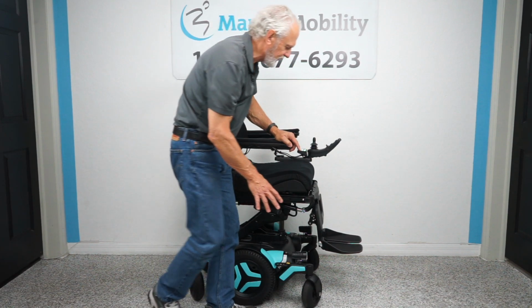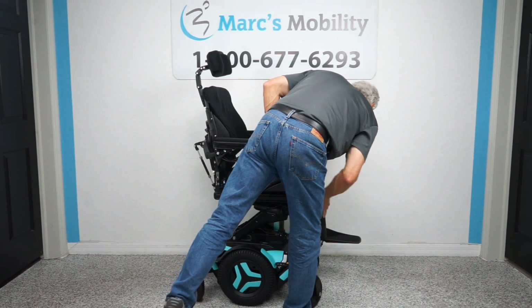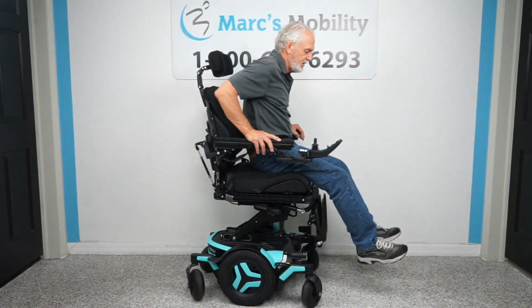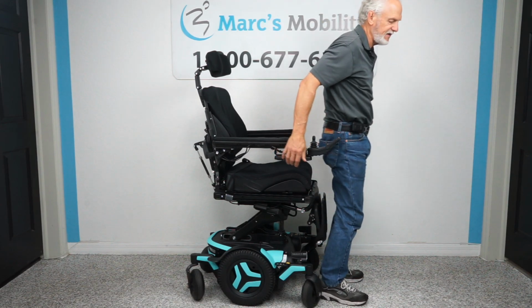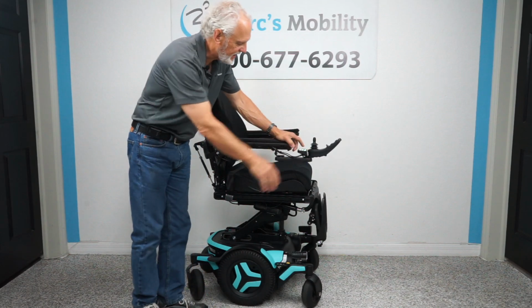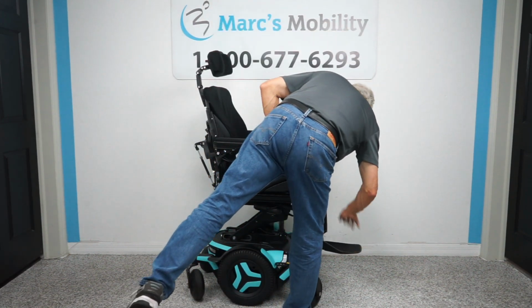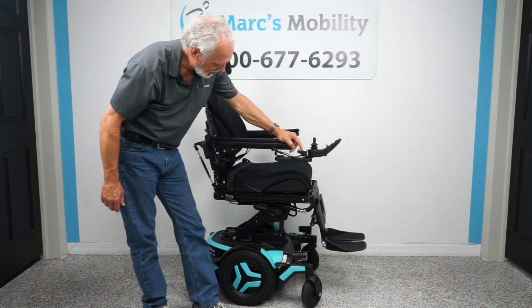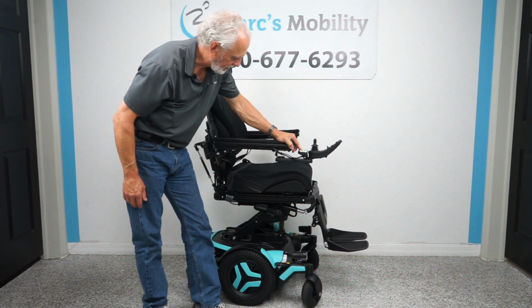So if you have someone who has trouble getting out of their chair, when the seat's elevated like this, look, they can just push off here and they're already standing. So they don't have to push hard to get out of their chair. So this helps getting out of the chair. I'll put the legs back out a little bit so it looks more normal. Bring the seat all the way down.